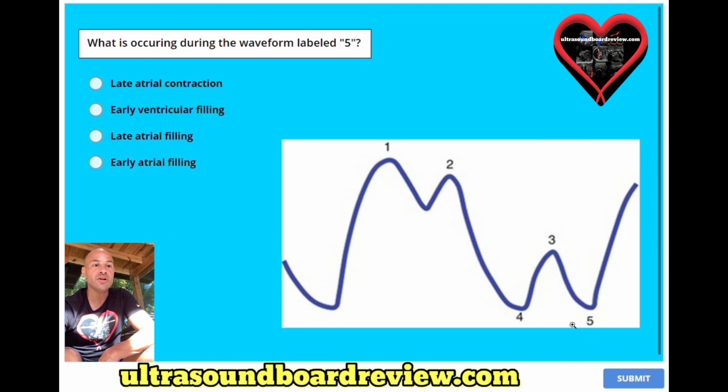So what is happening right here? The answer is B, early ventricular filling.